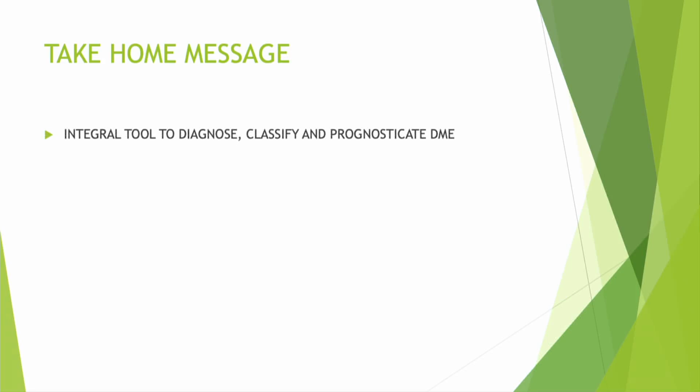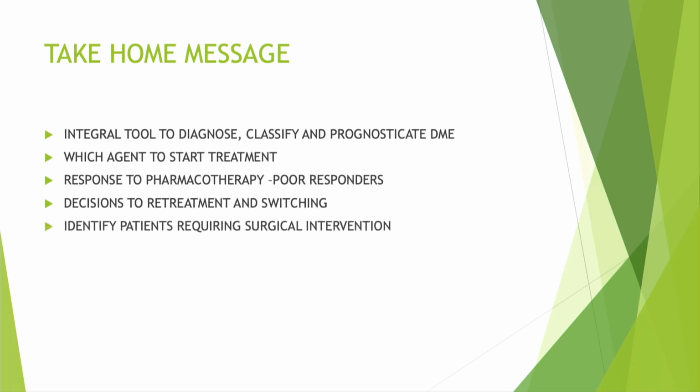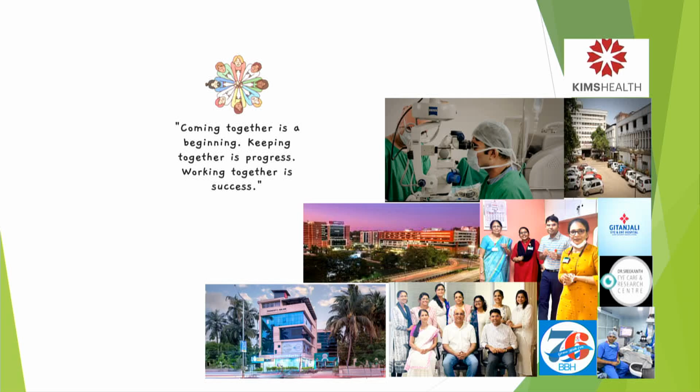So OCT is an integral tool to diagnose, classify, and prognosticate DME and identify which agent to start your treatment with, assess your response to therapy and identify the poor responders, and also to take decisions on retreatment and switching between agents. And it also helps to identify patients who need a surgical intervention. And OCTA has got a promising role by identifying disease in the preclinical stages and also identifying poor responders. Thank you.